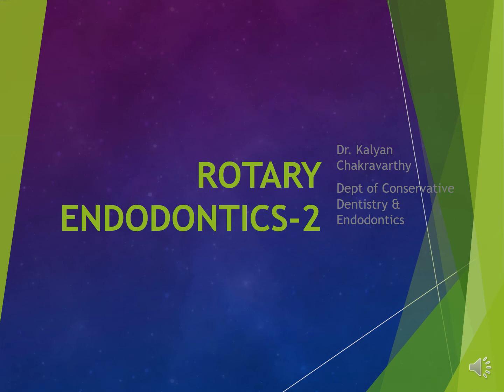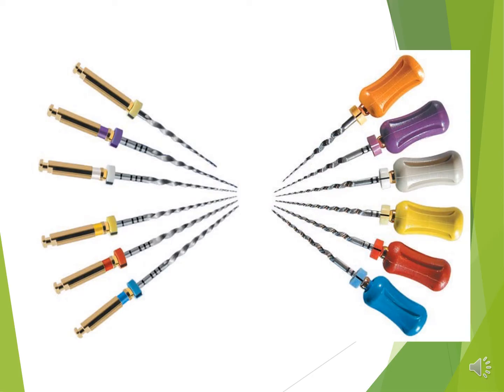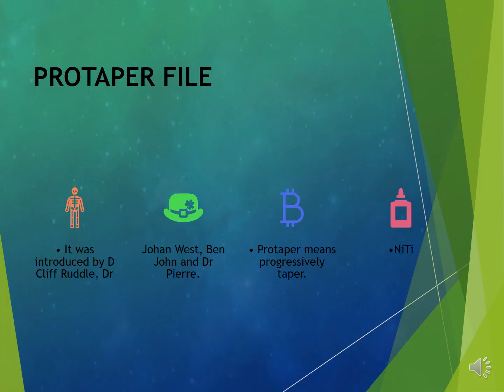Lecture in Rotary Endodontics 2 will be discussing Protaper files and Protaper Gold files, which are currently used for undergraduate training. These files are extremely popular and have been in the market for a very long time because of their ease of use, simplicity, and efficiency. The Protaper files were introduced by Dr. Cliff Ruddle, later popularized by Johann West, Ben John, and Dr. Pierre. Protaper means progressively taper, and the files are made up of nickel titanium alloy.